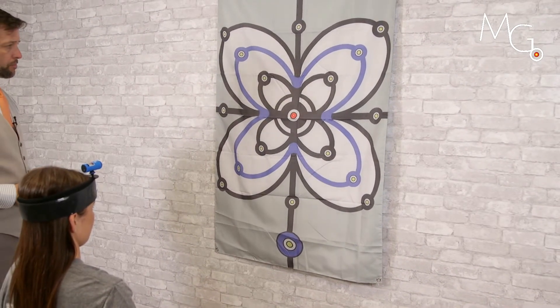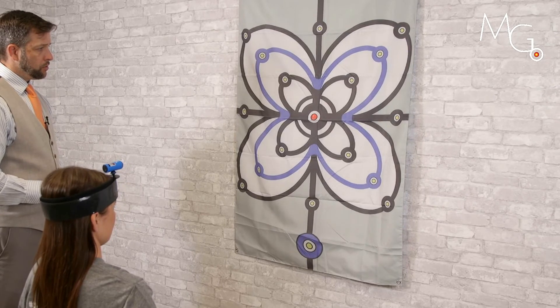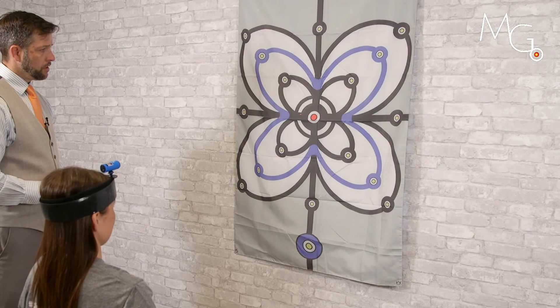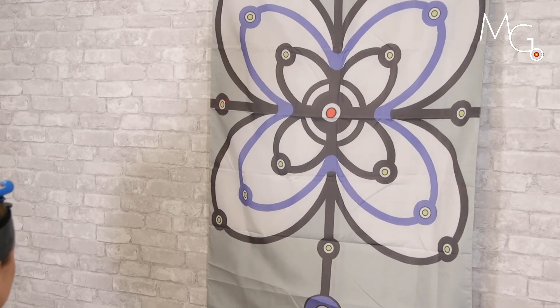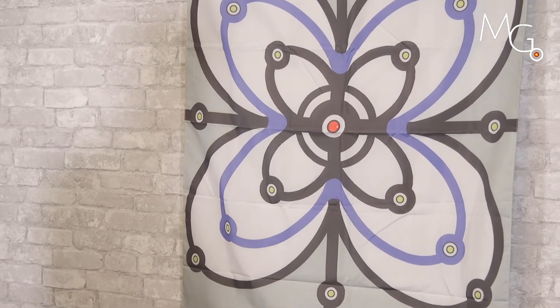We can work on visual targeting by having the patient move quick to the right, back to the middle, or quick to the left, as well as extension and flexion.